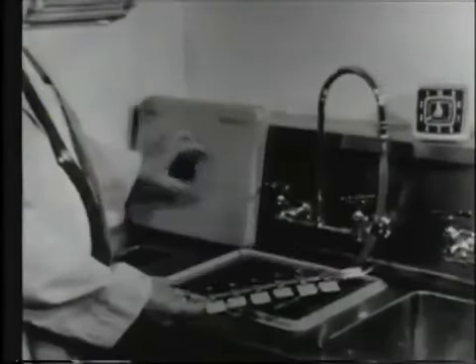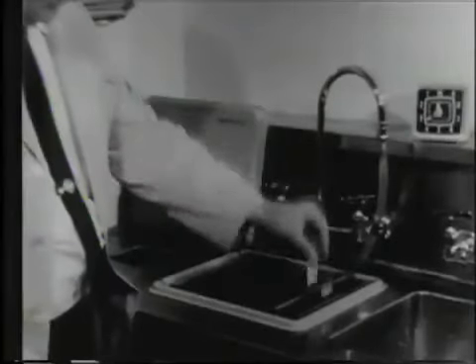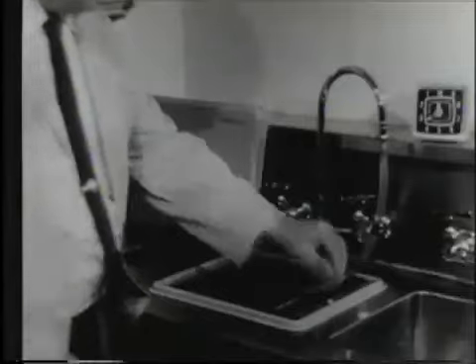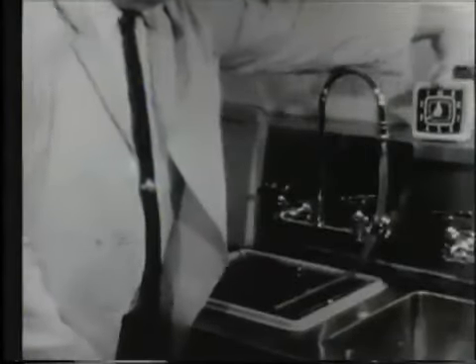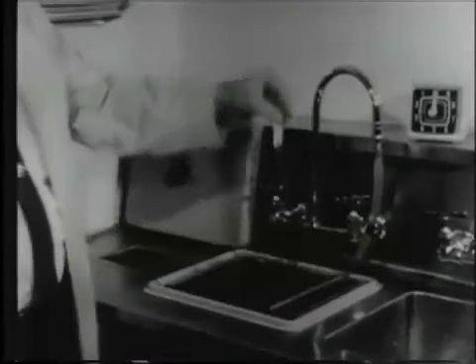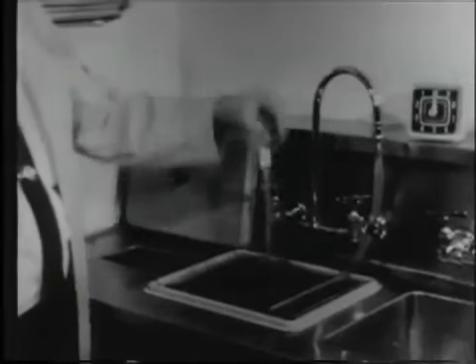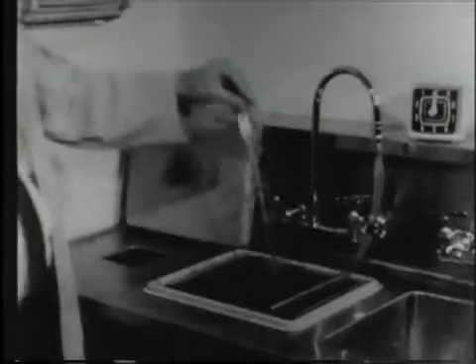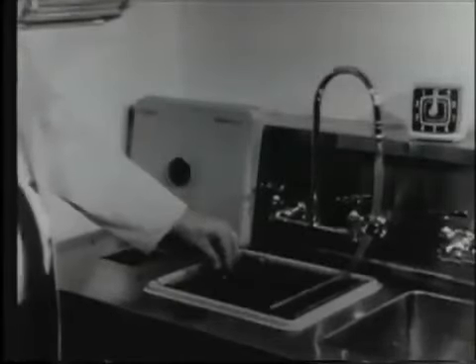Now we uncover the developing tank, place the rack of films in the developer, and agitate up and down just a couple times to dislodge any air bubbles that adhered. And then we turn on the timer by moving the control in the back. After the period has passed, the control rings. We rinse the film to get rid of any developer that is carried on the rack or the films, and then we put the rack of films in the fixer.